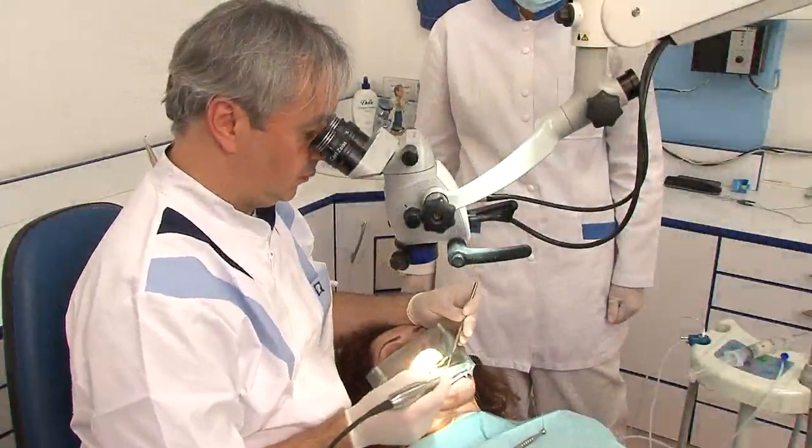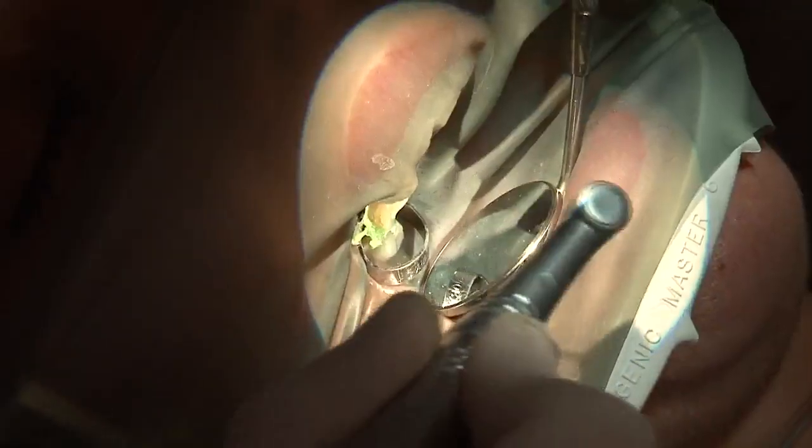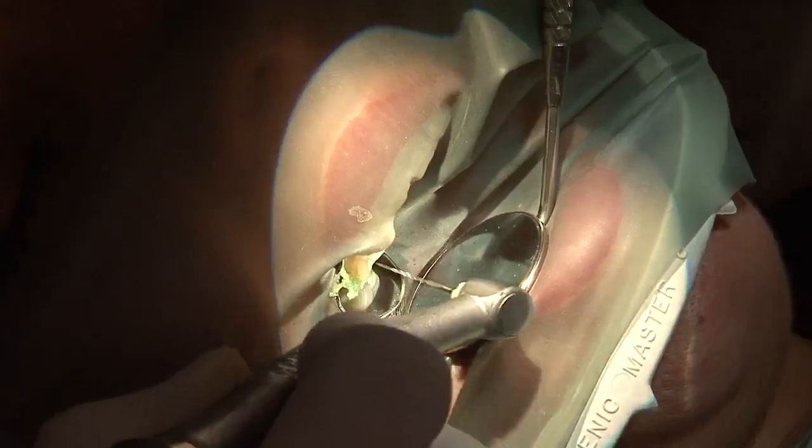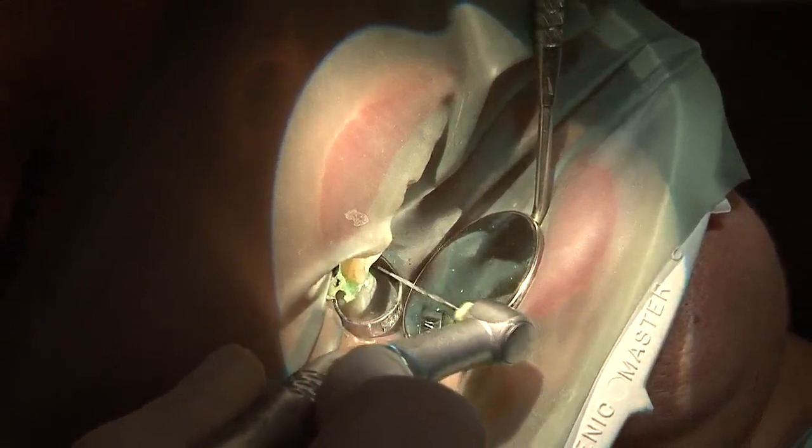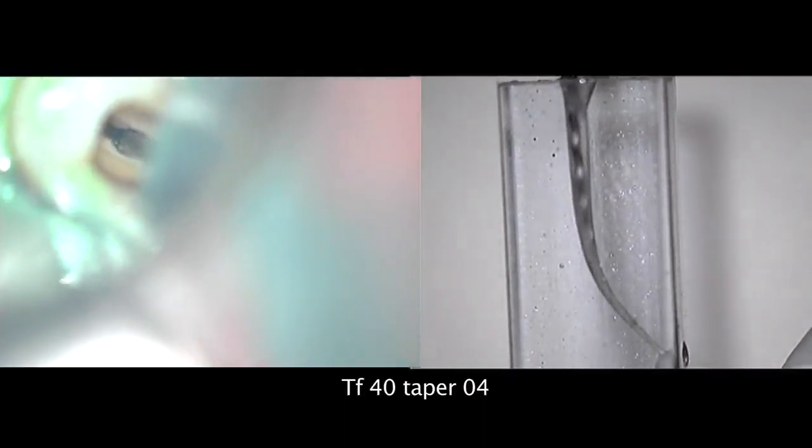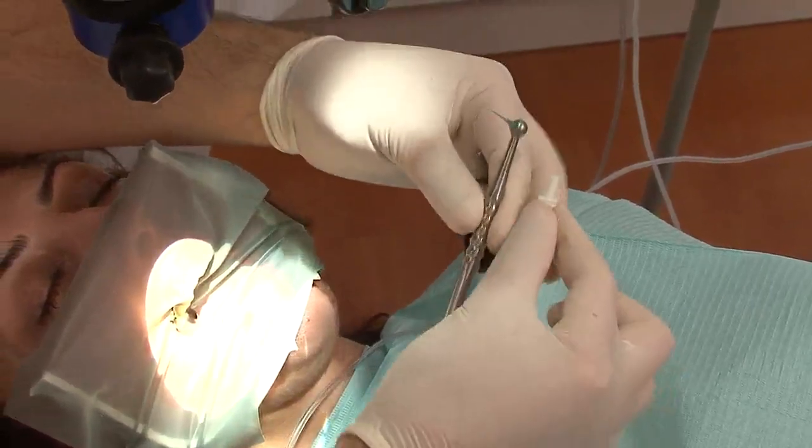Apical enlargement with TF 40 taper 4. I use the 40-04 in TFs due to the flexibility of the alloy. I can make the jump from 25-06 to 40-04 and I can enlarge my apical area to size 40 for different biological consideration. You can see that the debris are concentrated in the apical area of the file.